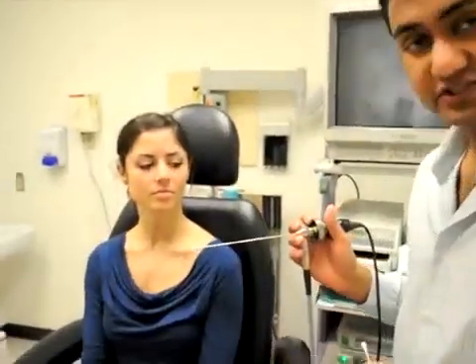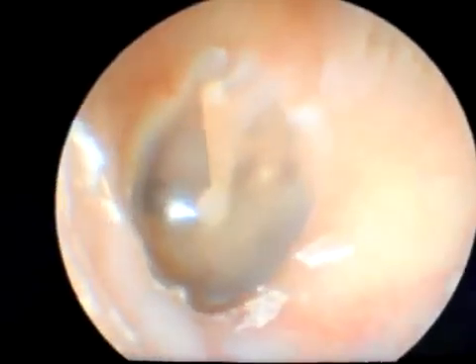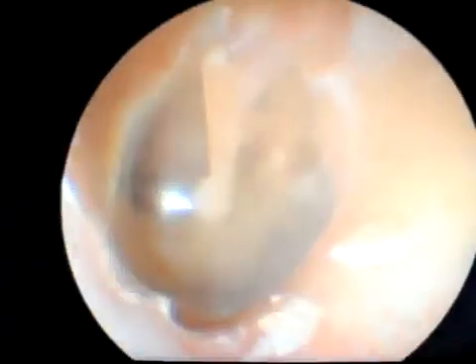We're going to use a rigid telescope or endoscope here and insert it into Brittany's ear to highlight the important structures that you should be seeing when you look with an otoscope. So I'm going to again grab Brittany's pinna here with my thumb and my index finger and pull and straighten out that external auditory canal. And the part that I'm straightening out here is the membranous or the cartilaginous portion. As I insert it and move past the hairs of Brittany's ear, we can see the bony external auditory canal and a beautiful view of her tympanic membrane.